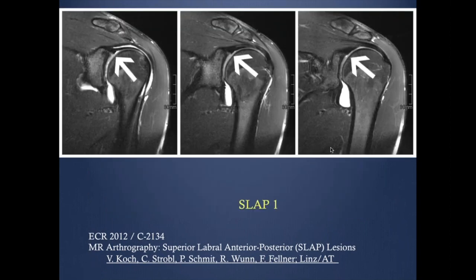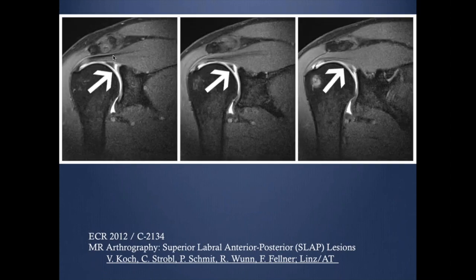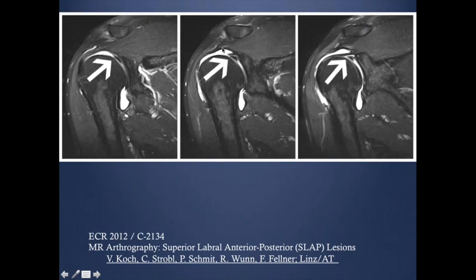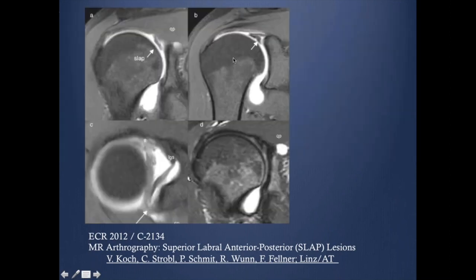I'll show you an example of each type. Type 1 shows irregular fraying of the superior labrum. Type 2 is when you have a linear signal — this is more than 3 mm detachment with a globular and irregular outline. Type 3 is when you have a separate fragment, which we call the bucket handle fragment. And Type 4 is when it extends to the bicipital anchor.